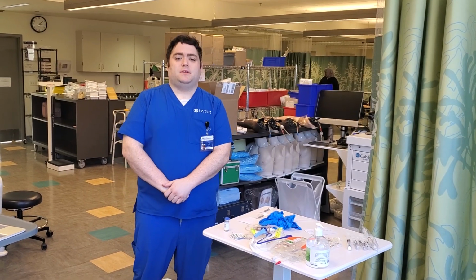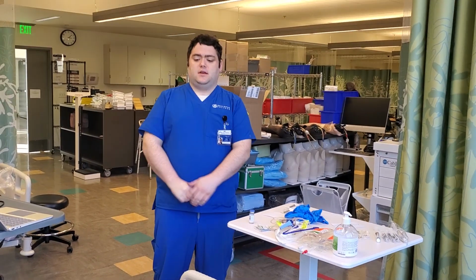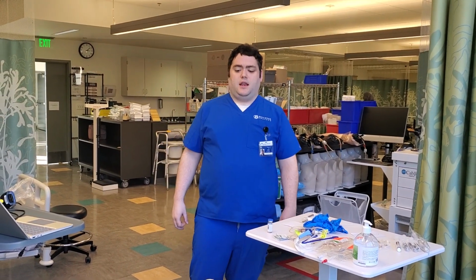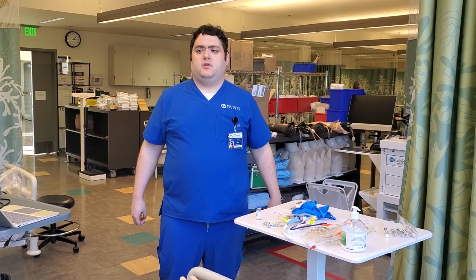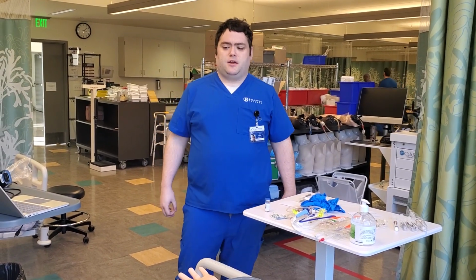Hi, my name is Kevin and I am here to do a demo video on IV skills. That will be setting up an IV push med, setting up a primary, and then doing a secondary piggyback.